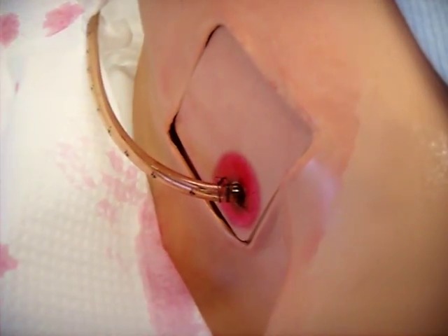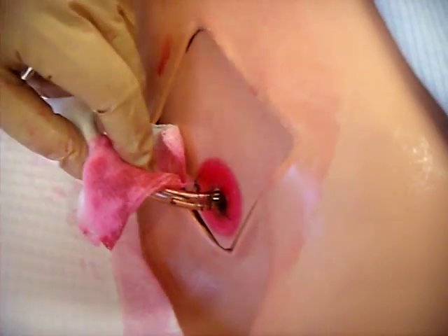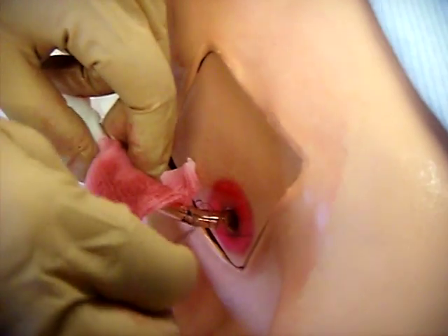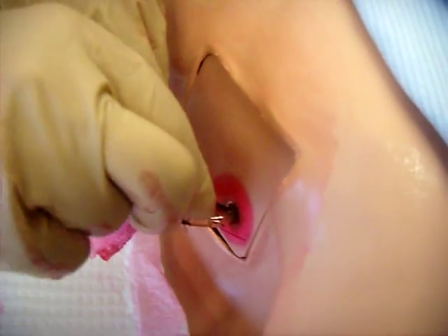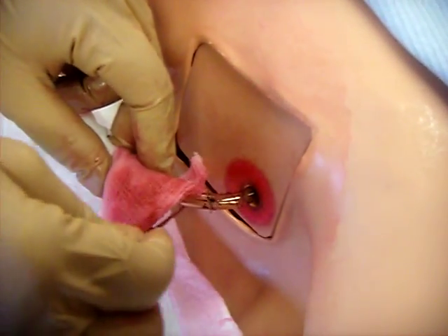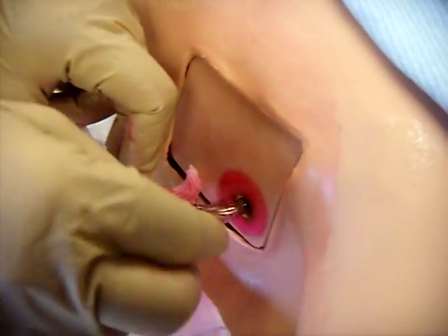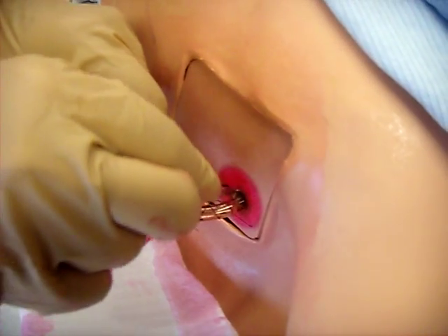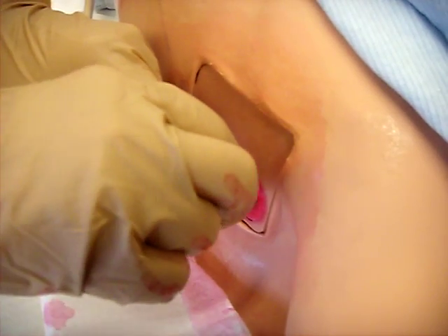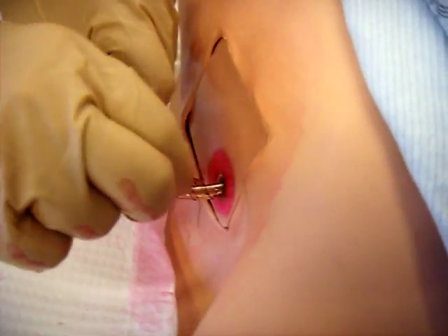Now, sometimes if I have to get a grip on the tube, I can use the sterile gauze for that, and just find my suture. There it is. Okay, seems to be good. And you'll notice it's going to be wrapped around several times. There. Now remember, when the suture is taken apart, the one thing that's used to hold the tube in is not holding it in anymore. So it's really important that you don't let the patient move around.